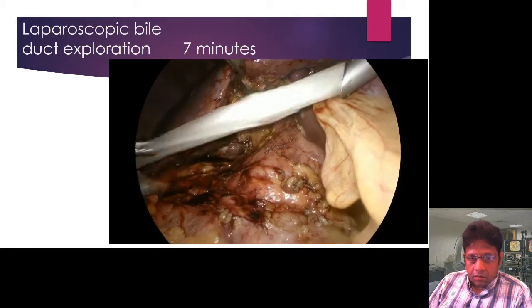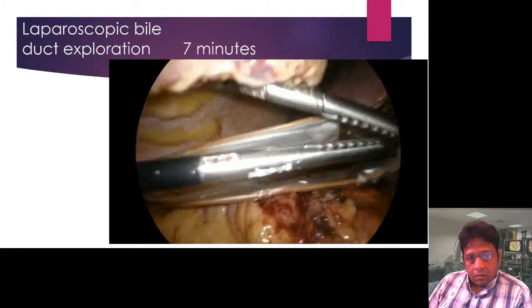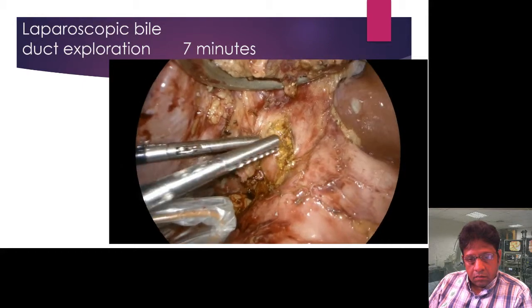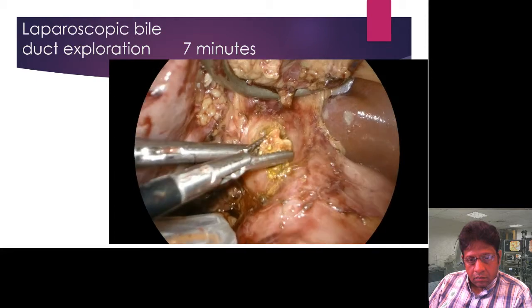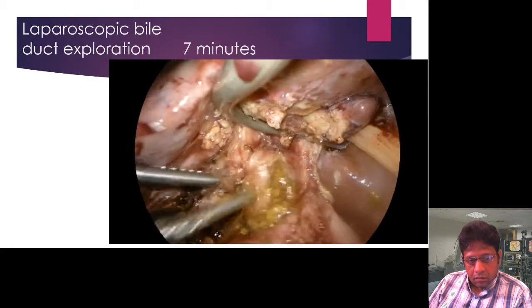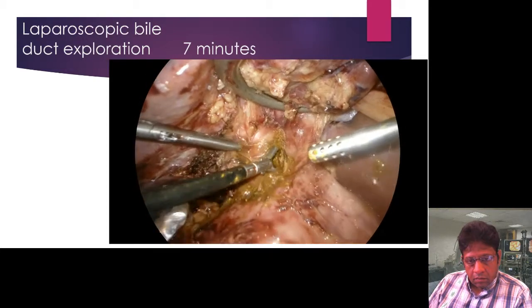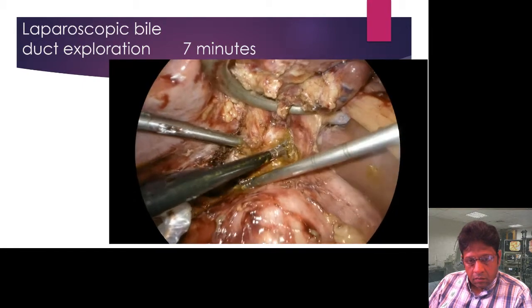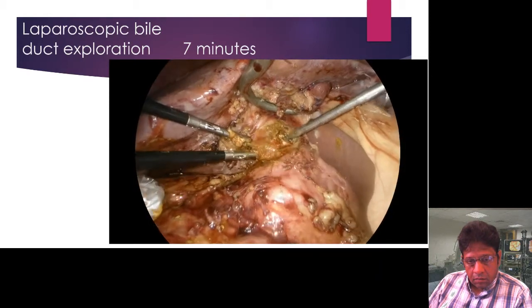To help keep the surgical field clean, I inserted a specimen retrieval bag and began disimpacting the bile duct carefully and meticulously. As the bile duct became more disimpacted, it seemed as though stones and debris kept coming to no end.